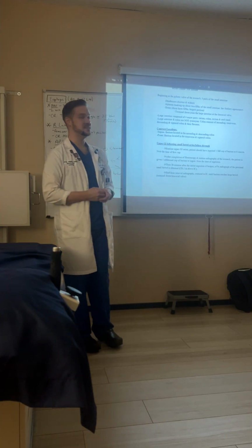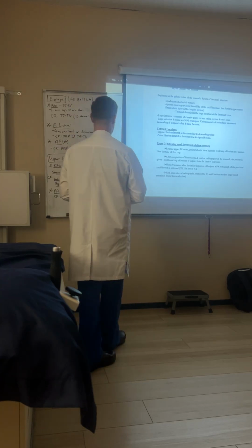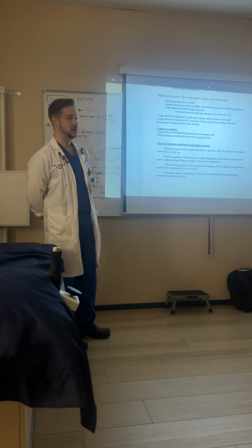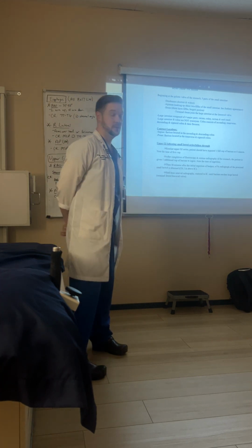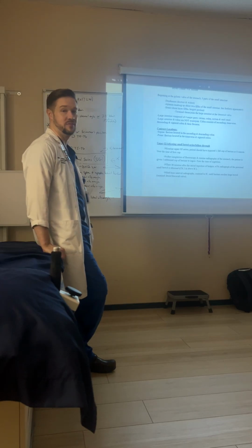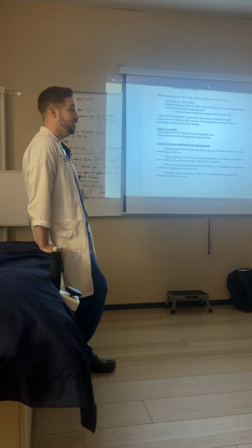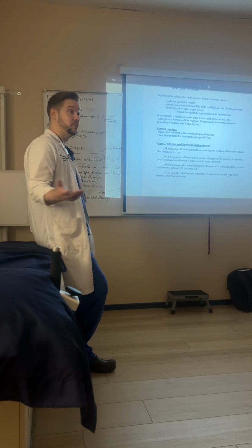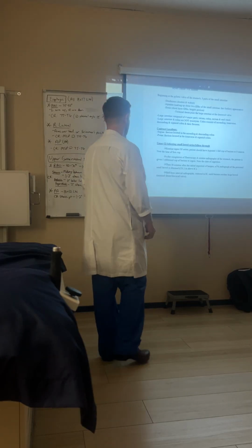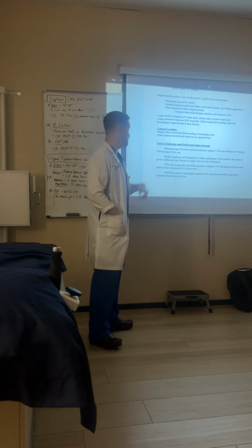Okay, so the study that we do to evaluate the small intestine is called a UGI-SBFT. UGI, small bowel follow-through, okay? Usually a small bowel follow-through follows an upper GI, okay? We never really do the small bowel follow-through without having done the upper GI. It just makes sense to do that because if you do the upper GI, you might as well follow it the rest of the way through instead of having them come back another day just for the small intestines. Make sense? So we're going to do the routine upper GI series.